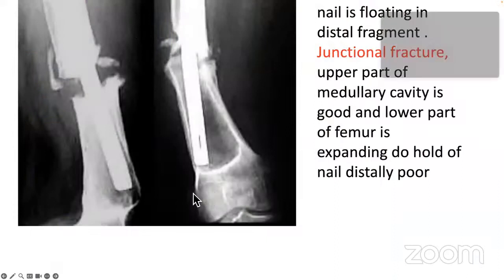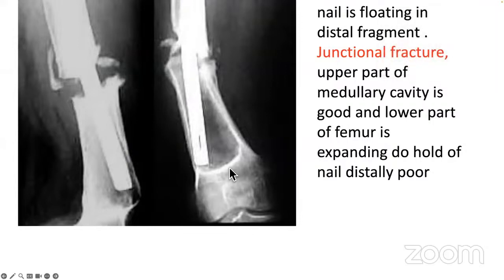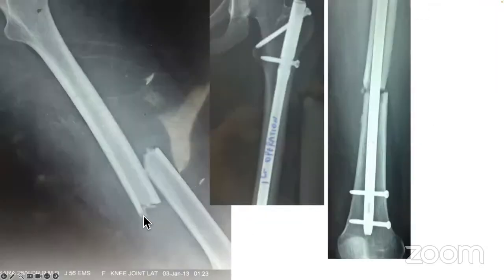You can see the lower one-third fracture. There is nothing holding it in this, and that's the reason the patient is going to move about and walk about, so this is going to sway around. You can see this fracture. When you put in two screws into this junctional fracture, this is notorious for going into non-union.